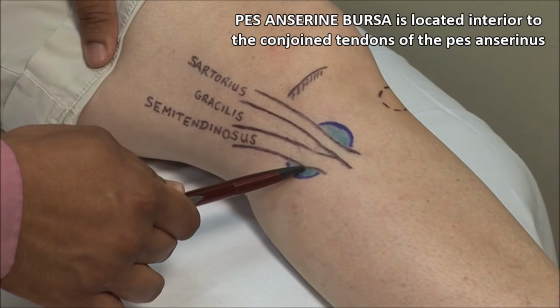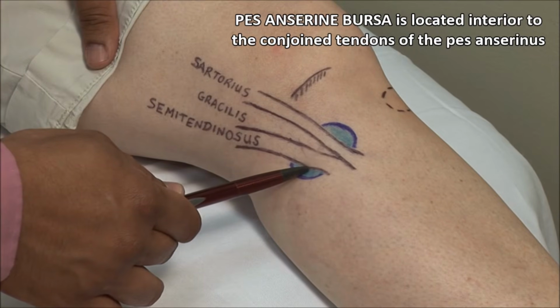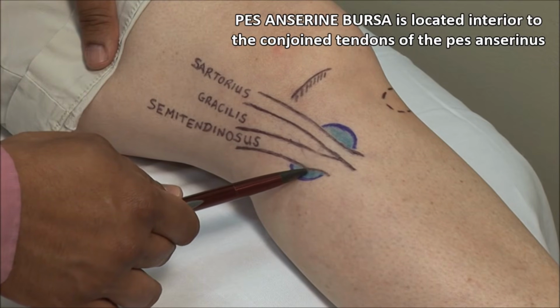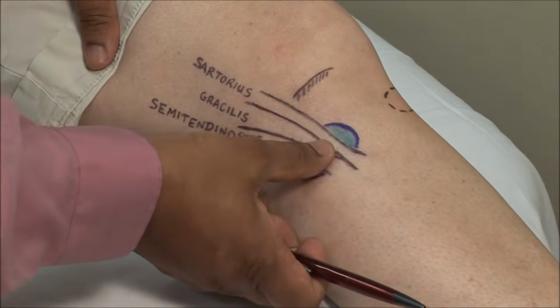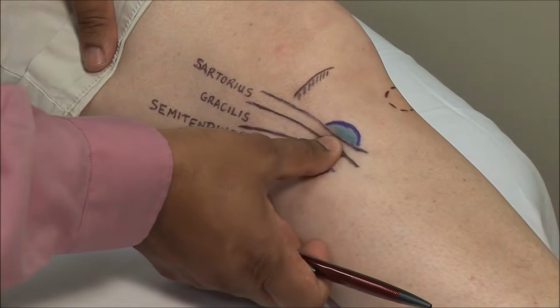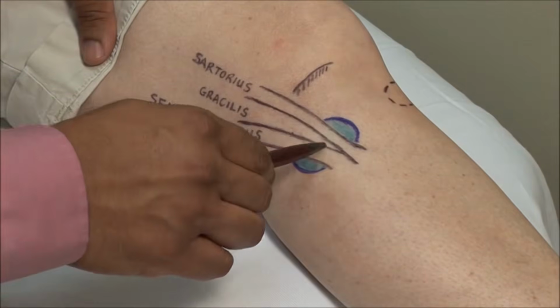Explaining the location to patients and pointing out that it is away from the joint line and the joint itself helps them to understand the diagnosis and the cause of their knee pain. Ask the patient for the point of maximal tenderness, and then, using a retractable pen, mark the point for injection.